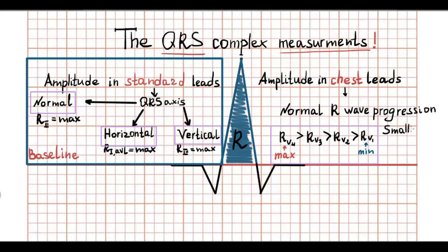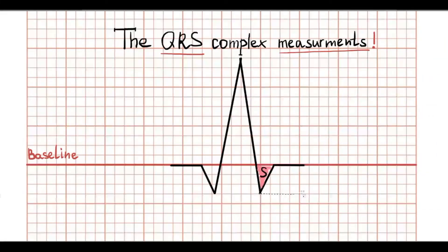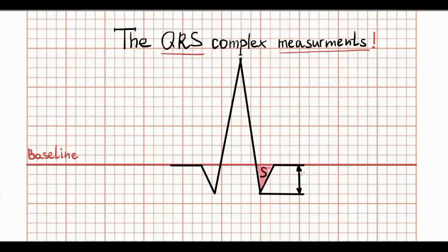Normally, in AVR, R wave can be very small or even absent. Let's go to S wave. The S wave represents depolarization of ventricular basal parts. In amplitude, S wave can be varied and even absent.